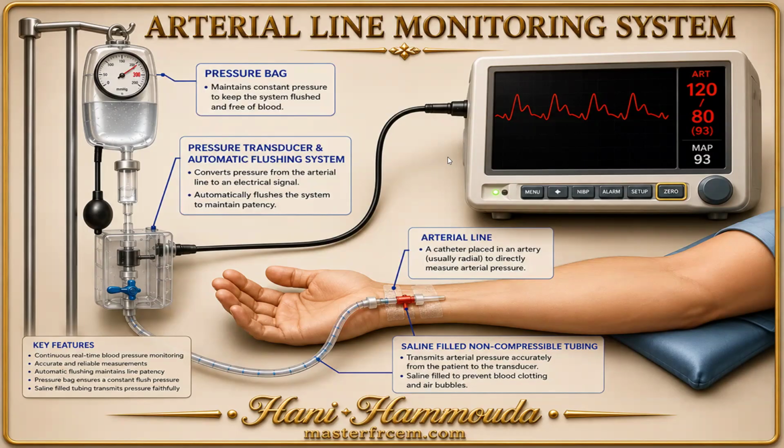How to do zeroing? What does it mean zeroing? How to see the waves? Once you connect, no waves, black. How to see these waves? How to see the blood pressure, invasive blood pressure?